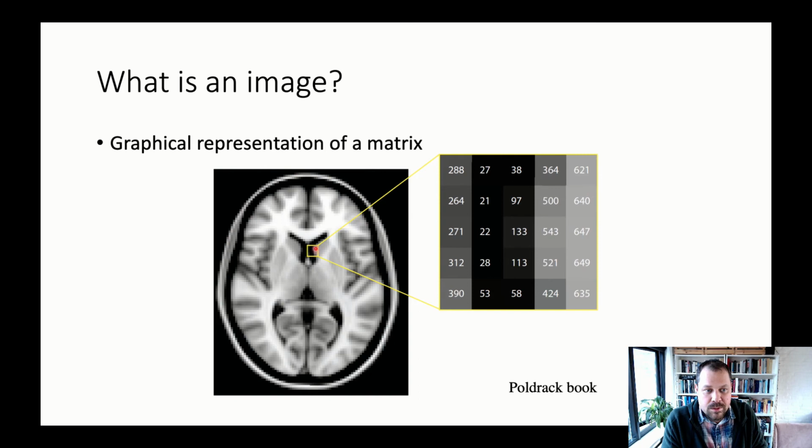Let's say we focus on this voxel in the caudate nucleus here, and it's a reward-related task, then we might see that whenever the subject sees an outcome of a positive reward, then this signal goes up. Whereas whenever he or she doesn't see that outcome, then this signal goes back down again.